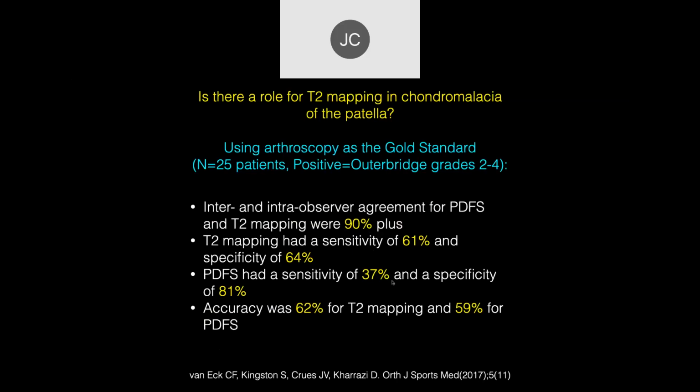PD FATSAT had a lower sensitivity, but a higher specificity. Overall accuracy was 62% for T2 mapping, 59% for PD FATSAT. But what this showed us is that there is a fair amount of disagreement between MR and arthroscopy.